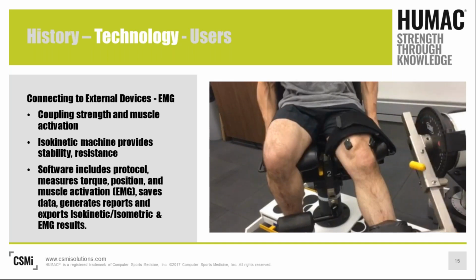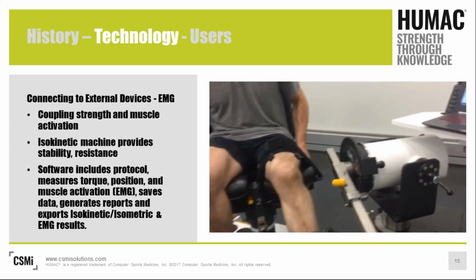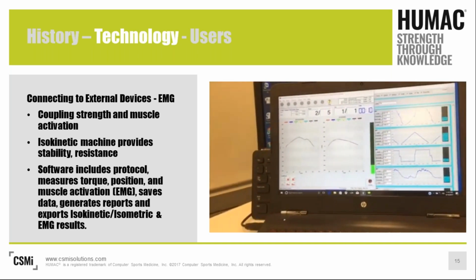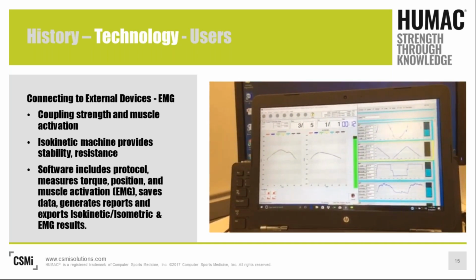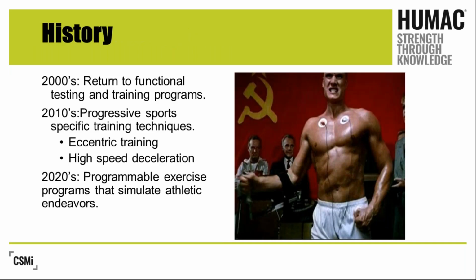And as our future continues, we'll be able to look at a lot of the software to give us these protocols that measure torque, position, muscle activation, and be able to generate that not only in research, but in return to play. And the future is actually bright when we really talk about what we're able to do. What I'm especially interested in is some of the Europeans are looking at being able to use force velocity training techniques and enhancing a lot of their players to be able to go back.